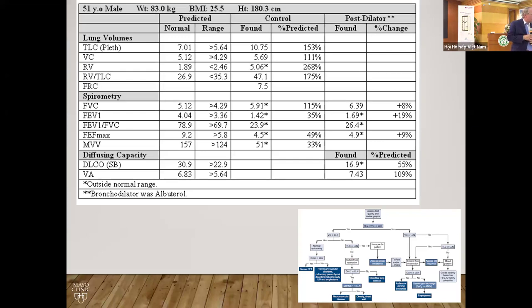So, you see the values of the TLC is up to 11 liters, and it seems very big for this. It may be very, very big. Yes, so maybe. But he is 180 centimeters tall. The other thing is that sometimes plethysmography, in particular if they did a faster pant rate, may overestimate the lung volume itself too. But he's 180 centimeters tall, a big gentleman, big chest, hyperinflated. You know, he's going to be barrel chested, a lot of air.